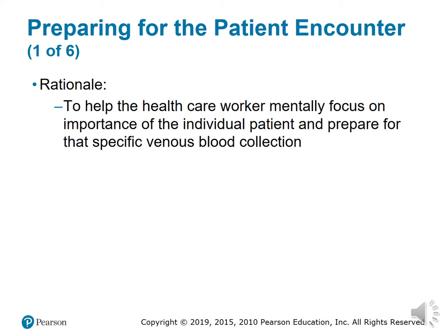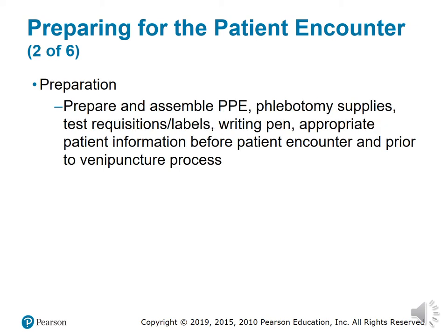Preparing for the patient encounter: the rationale is to help the healthcare worker mentally focus on the importance of the individual patient and prepare for the specific venous blood collection. Preparation: prepare and assemble PPE, phlebotomy supplies, test requisitions, labels, writing pens, and appropriate patient information before patient encounter and prior to the venipuncture process.